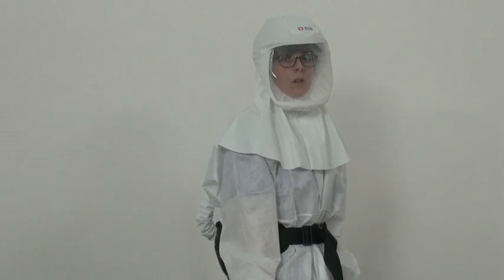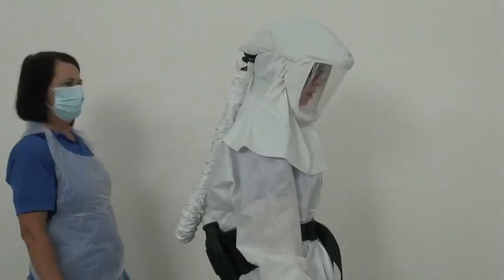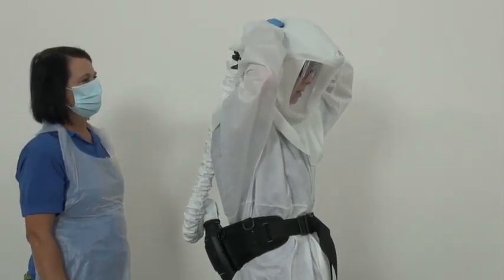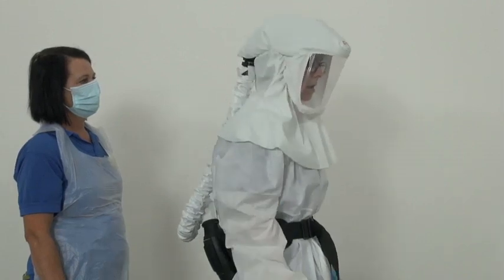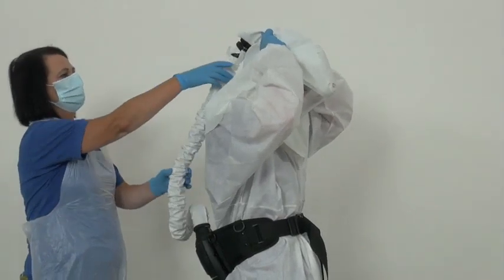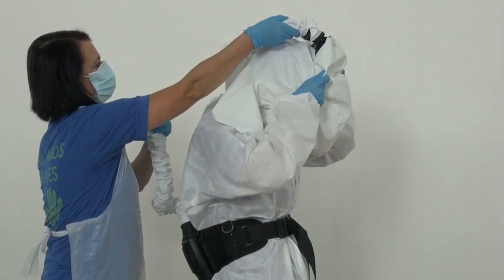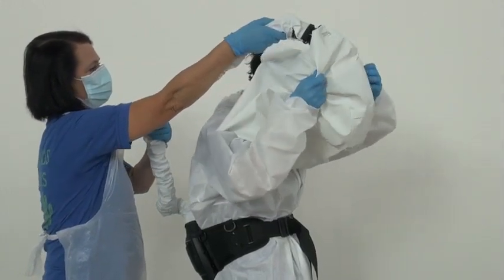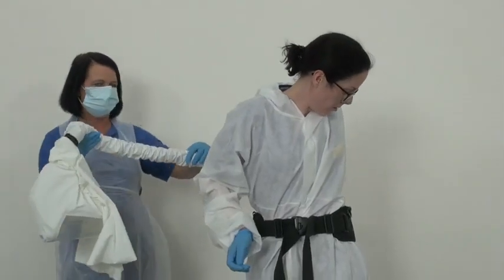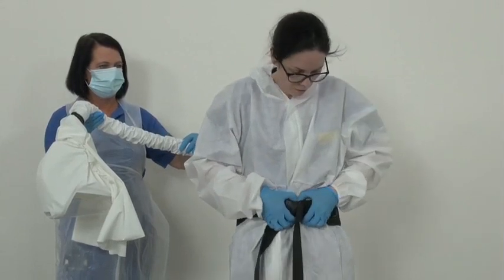Removal of hood: use body to assist. Loosen the headband by pressing the slider left to right. Tuck chin. Bring hood forwards to take off — avoid contact with face. Carefully turn it off. Remove waist belt.